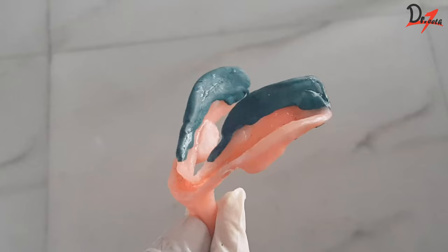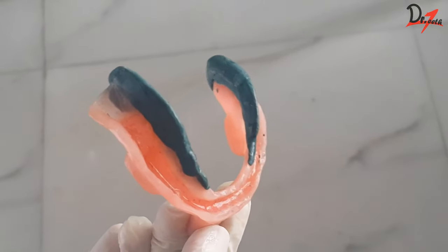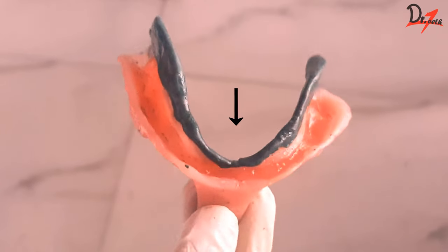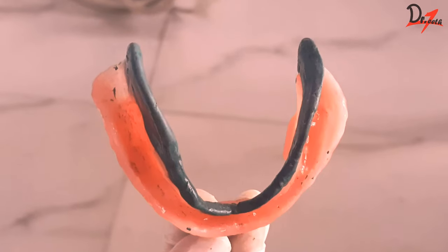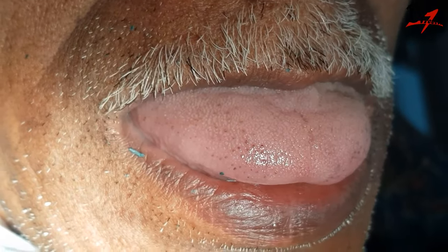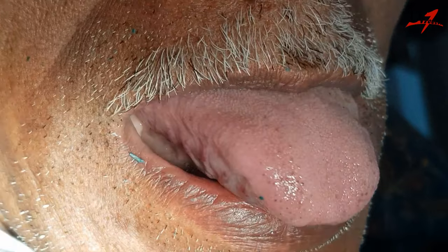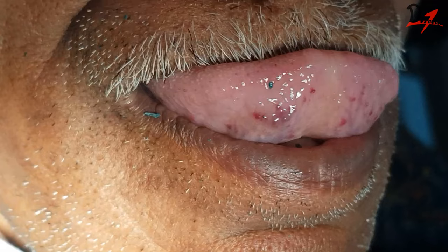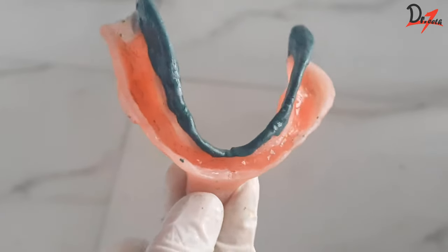Next we would be recording the anterior lingual flange. Again, we'll apply the green stick, mold it with our fingers, and put it in the patient's mouth. Ask the patient to protrude the tongue and also push the tongue on the anterior part of the palate. Protruding the tongue develops the length, while pushing the tongue against the anterior palate develops the thickness of the flange. This is how it will look.